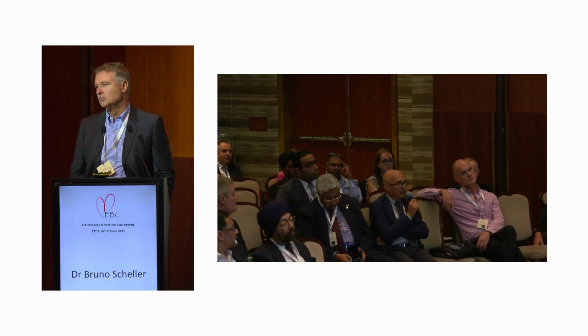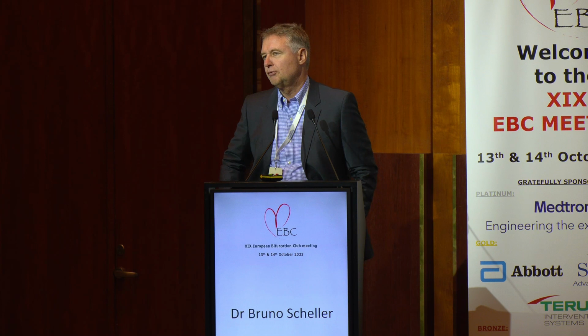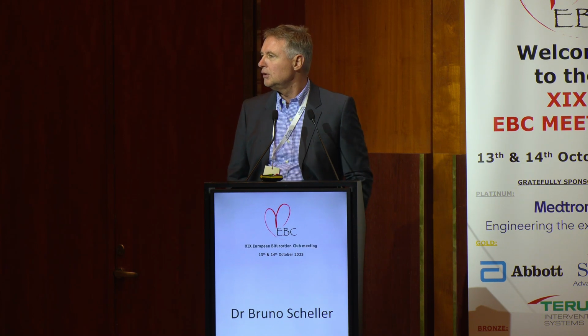One of the challenging issues in acute coronary syndromes is the plaque shifting on bifurcation. When you have a significantly compromised side branch, what will be the next step? You mean after treating the main branch? Yes, yes. Then you have the option to do a kissing with uncoated balloons. You cannot avoid kissing.